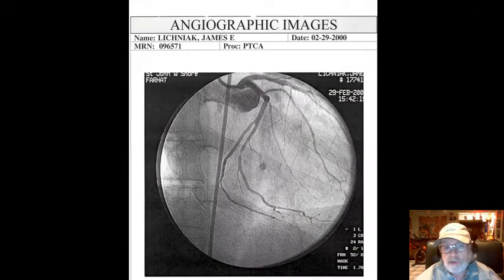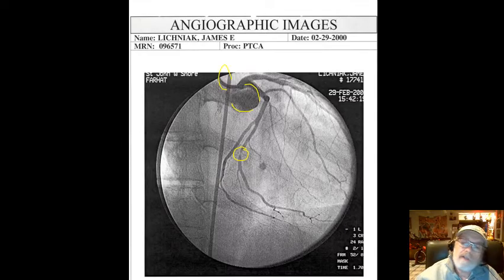This is me. Now, we talked about this in class. Here's the aortic sinus. You can see the aortic sinus really well. And you can see the catheter right there. The thing I want to point out, and why the angiograms help, is that some people may be involved in interventional radiography, where they're doing radiographs of arteriograms and things like that. Basically, what we see right here is an area where there's a blockage, where the lumen has narrowed off. You can actually see that quite well.